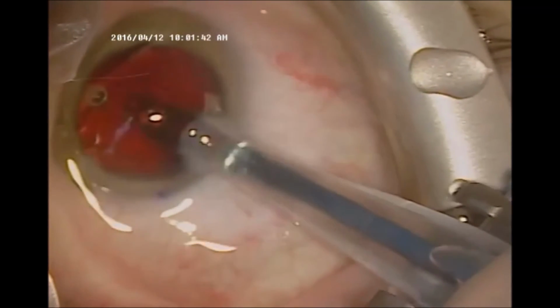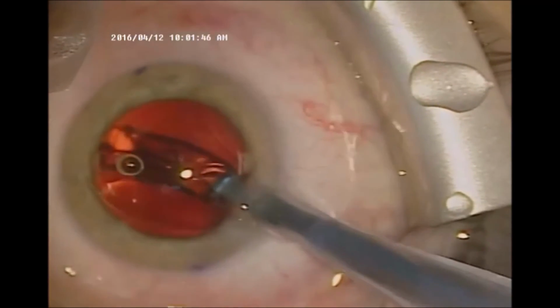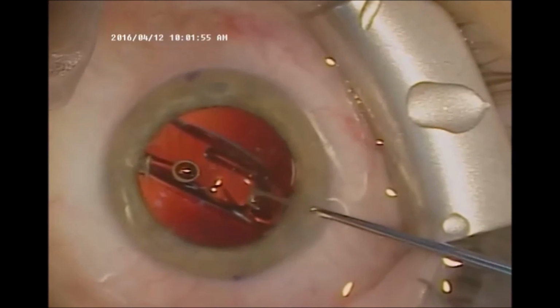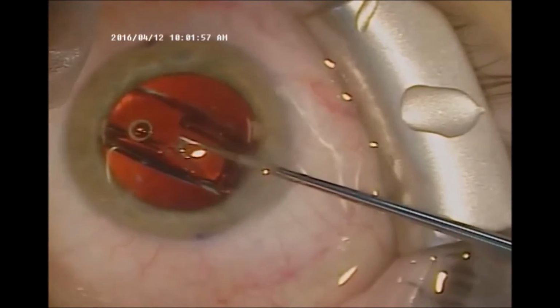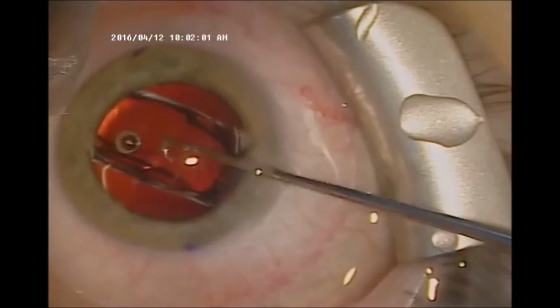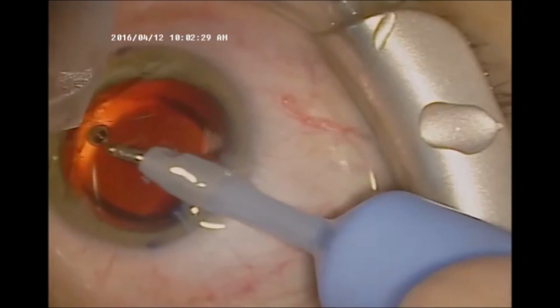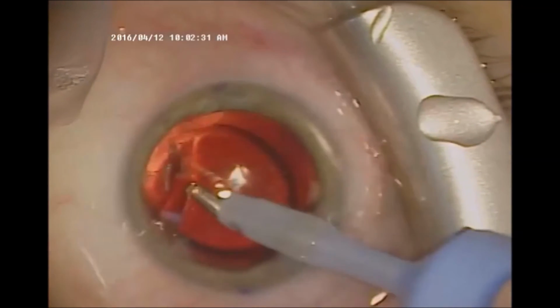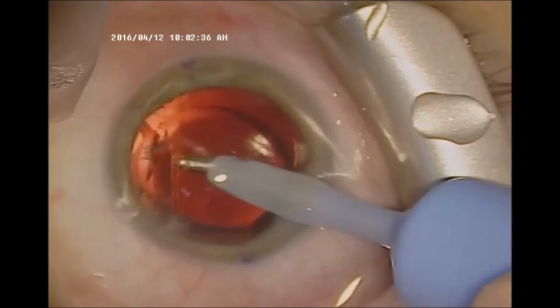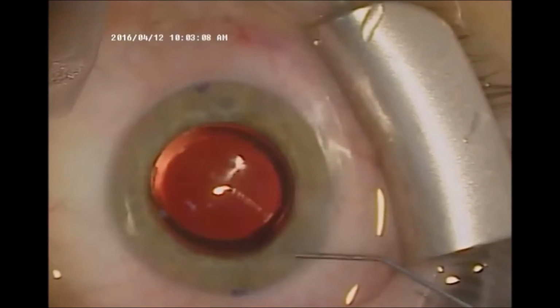It is rolled up similar to a taco. And then I'll be using another instrument in order to unroll the lens within the lens capsule. Perfect. Then I use the irrigation and aspiration again in order to remove the viscoelastic material from the eye. And I also tap the lens in order to make sure that any material is removed from underneath the lens.